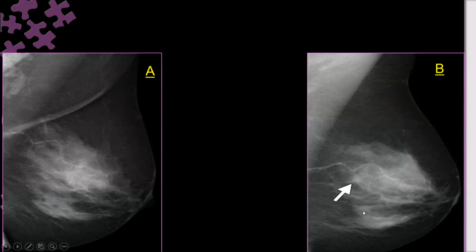And to compare, to make sure this is better than this one, look for the resolution. First of all, here, a folding. Here, there is no folding. Okay, stretch well. Look for the margin of the pectoralis, how it is sharp here. Look even for the contrast and delineation, differentiation of the breast tissue, how it is very clear in this image compared to that image. And even the skin, the contrast and spatial resolution, both of which.